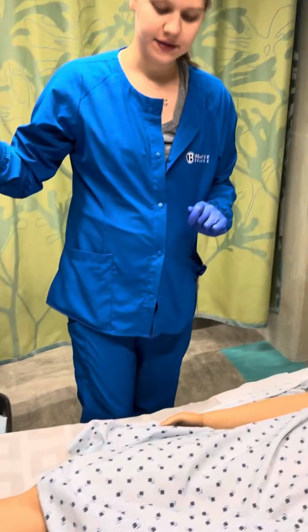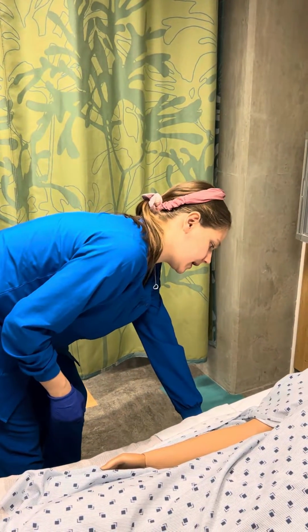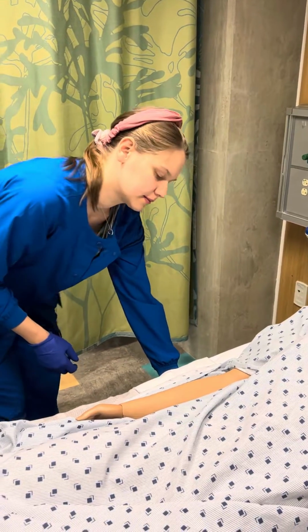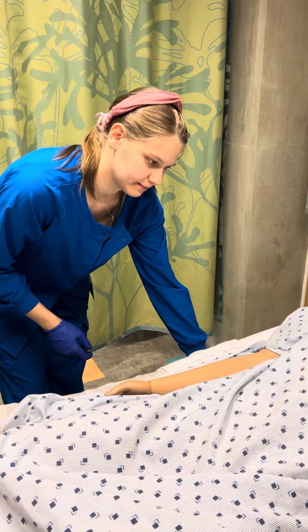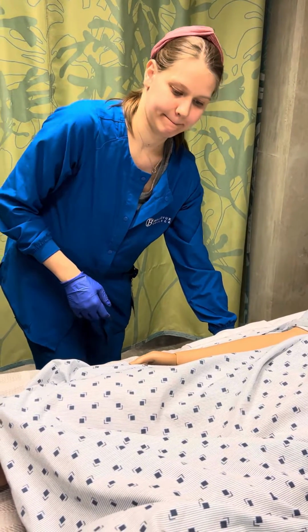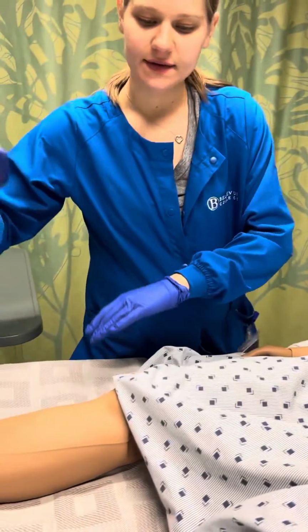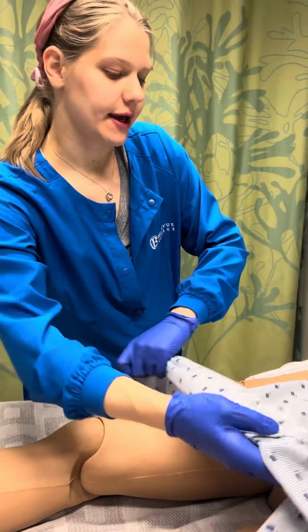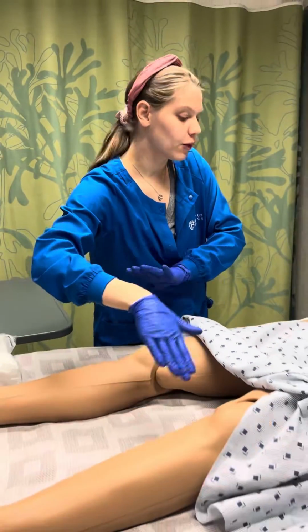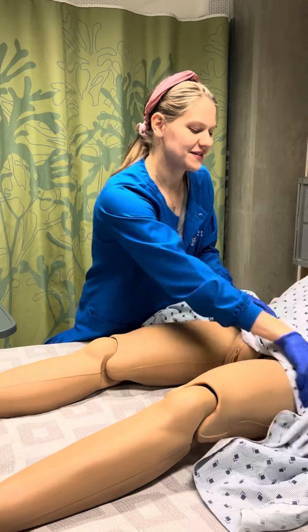And I provided privacy for the patient. I'm just going to raise your bed to a comfortable working height. Great. And privacy is provided. I'm going to lift your gown. I'm going to put a blanket on the lower half of the patient's body just to keep her warm and to make her feel a little bit more privacy has been given to her.